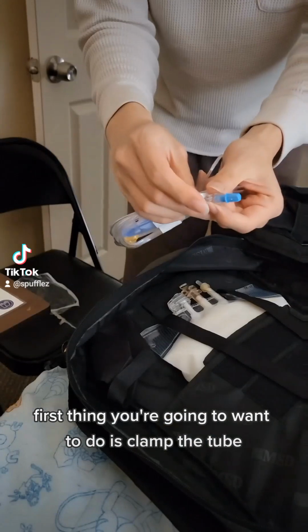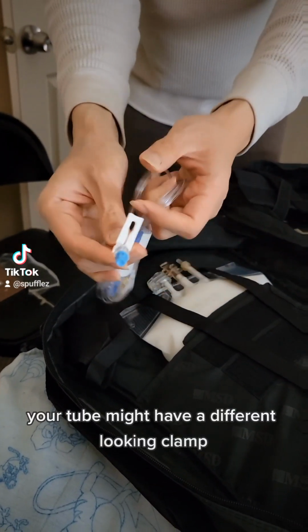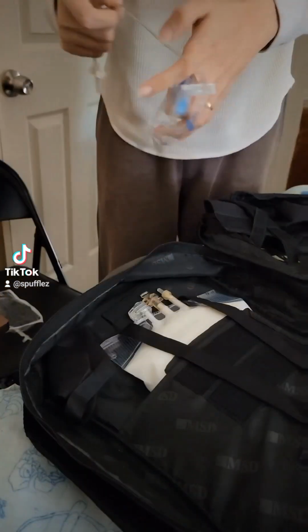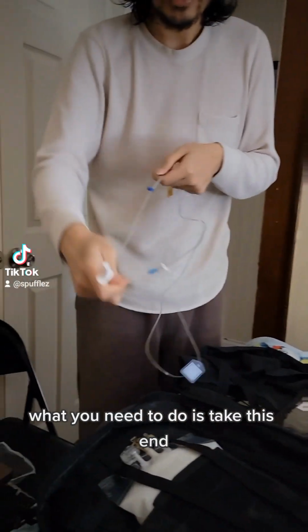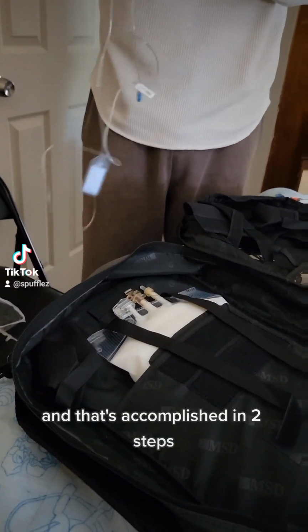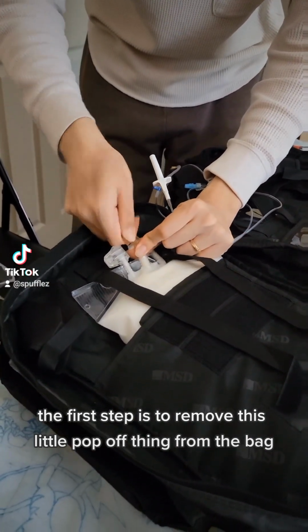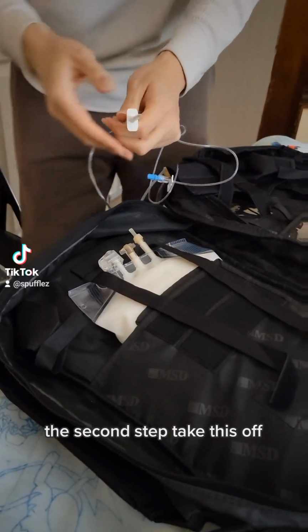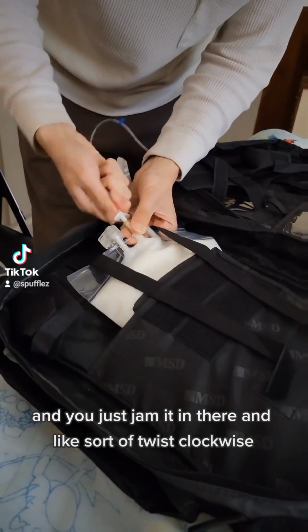First thing you're going to want to do is clamp the tube. Your tube might have a different looking clamp, but you don't want liquid to flow through before you're ready because it'll make a mess and get everywhere. Once you have the tube ready, what you need to do is take this end and spike it into the bag over here. That's accomplished in two steps. The first step is to remove this little pop-off thing from the bag. And the second step, take this off. And you just jam it in there and sort of twist clockwise.